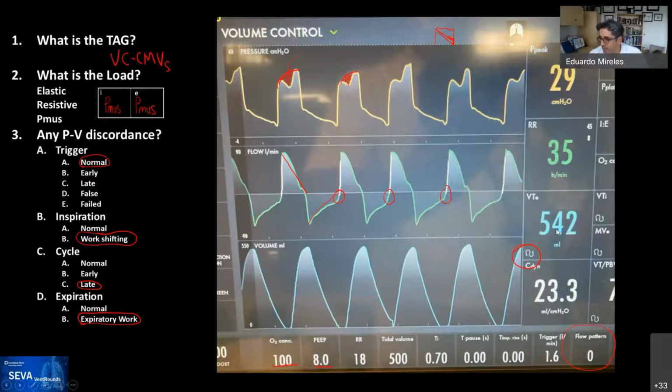Do you want to comment on it? That's not going to help, because we found that it doesn't answer this question. The problem was unexpected tidal volumes with pressure control with adaptive targeting, not this situation.